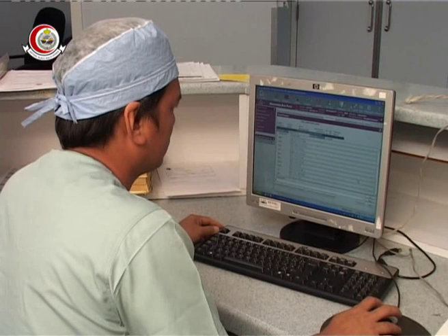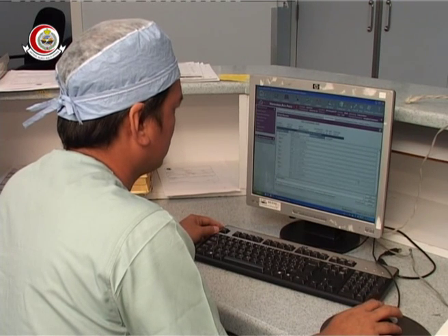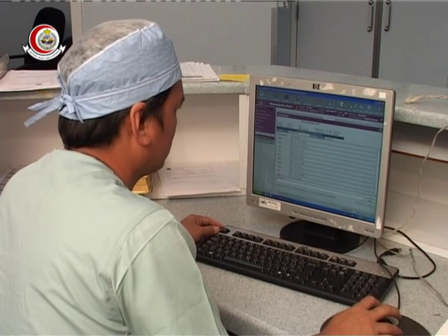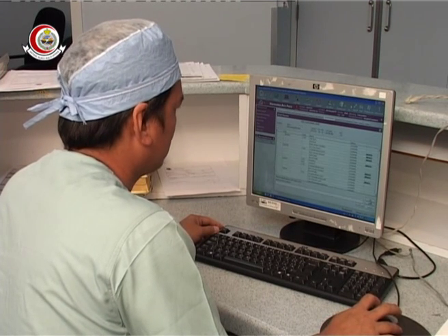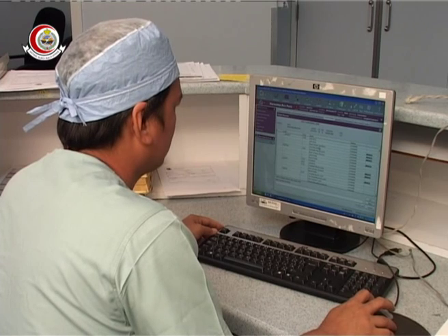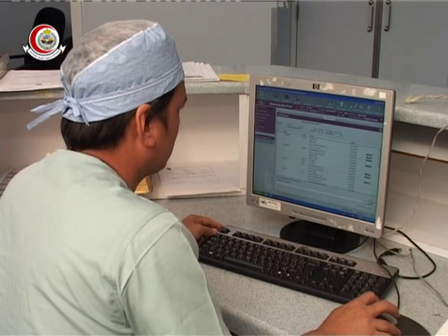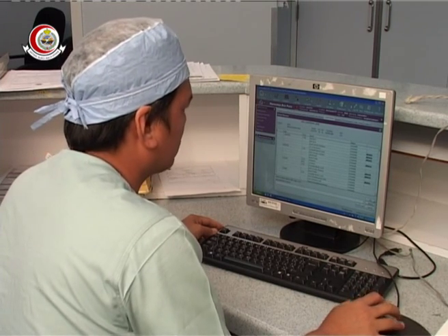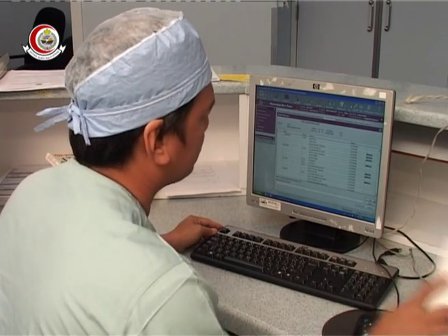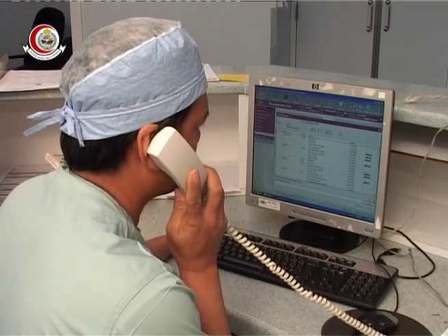The angionurse is checking the patient's coagulation profile and other necessary data from QCPR. The angionurse then contacts the ER and asks to bring the patient to the angio department.